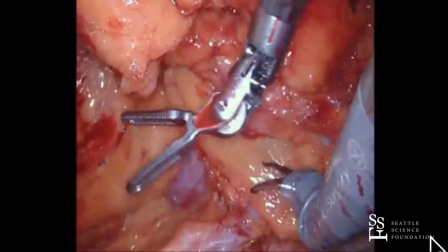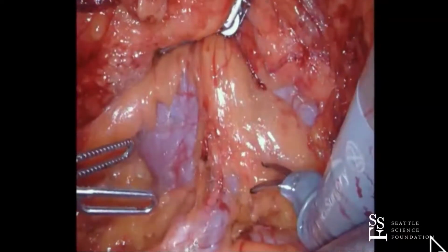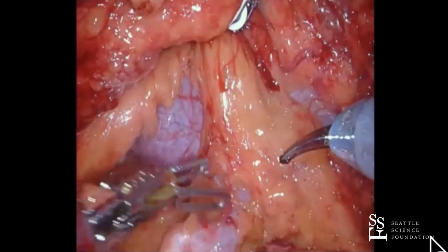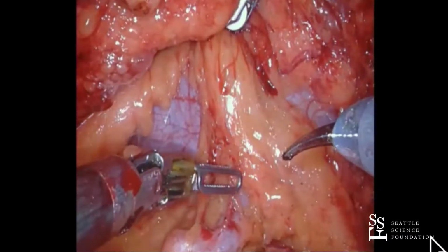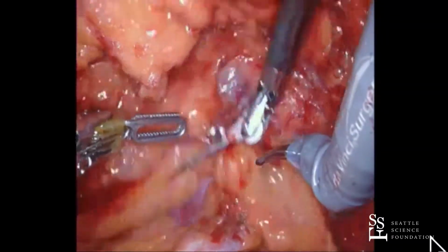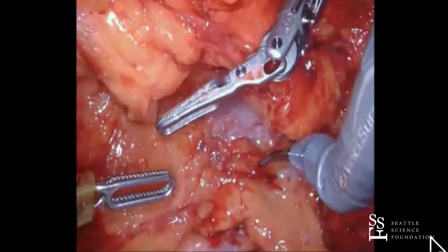Brando, I got a conflict outside with the fourth and my right arm. Can we separate them a little bit? Let me get off the tissues here, but I think we just need to push, we need to get a little separation there, okay? Hold on a second, let me get off the tissues. Give me a little more space there if you can, okay?